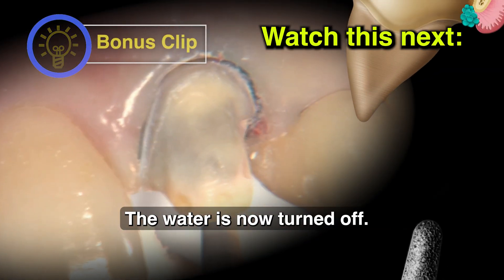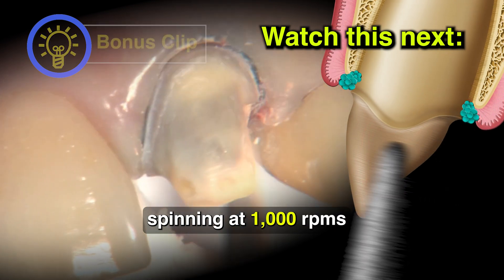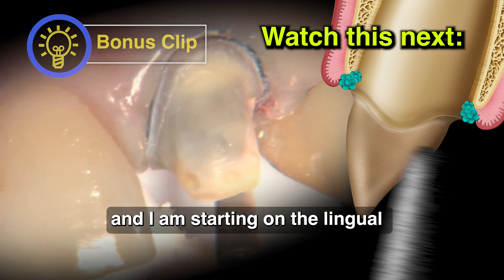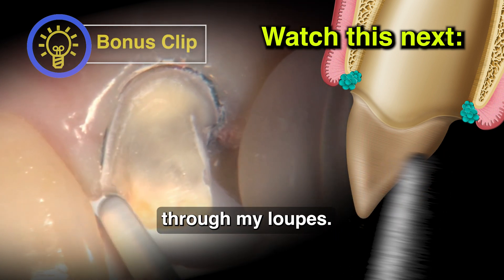The water's now turned off. I have my 856-025 bur spinning at 1000 RPMs, and I'm starting on the lingual and going around smoothing my margins. I'm looking at this at 5x through my loupes.